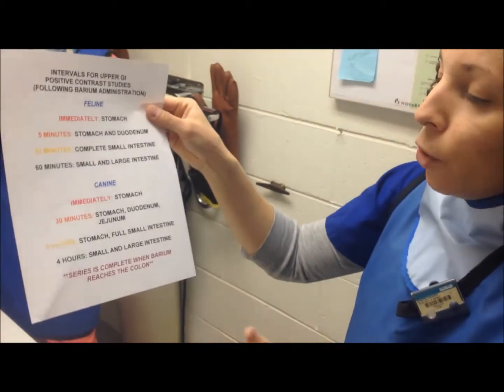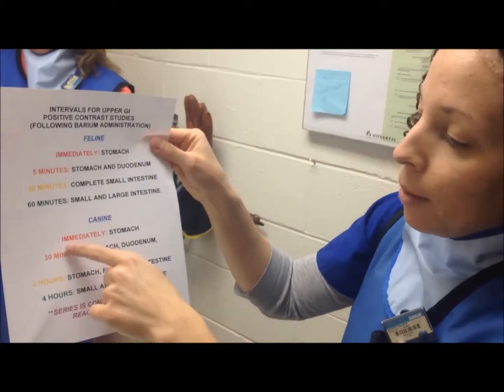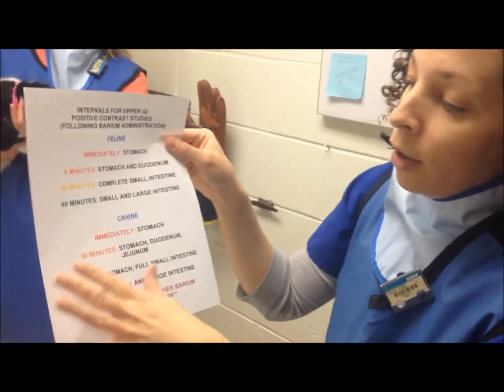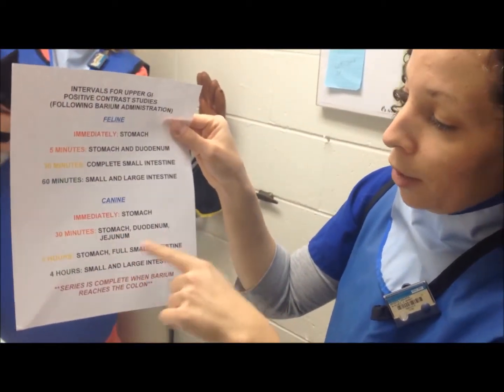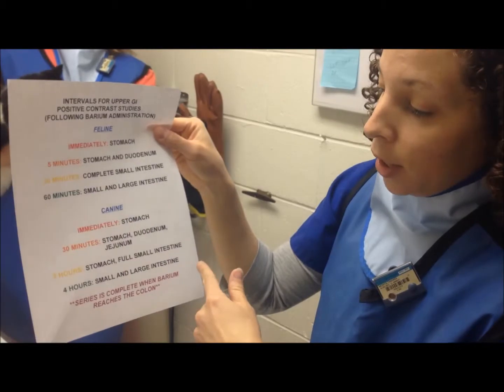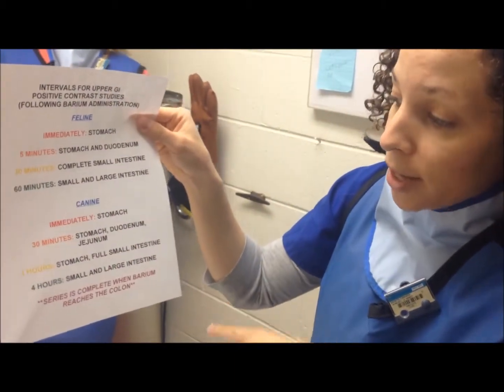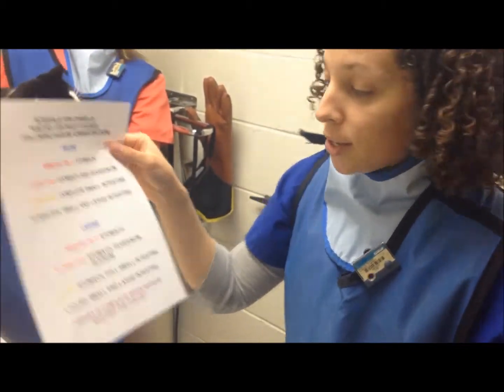For canines, their GI transit time is a little bit slower. So again, the immediate view that you would get for a canine patient, you'd get your stomach. For 30 minutes after administering the barium, you get the stomach, duodenum, and jejunum. Then 2 hours later, it'll still be in the stomach, and you can most likely get the full barium in the entire small intestine. And then 4 hours after administering, you'll get the small and the large intestine.